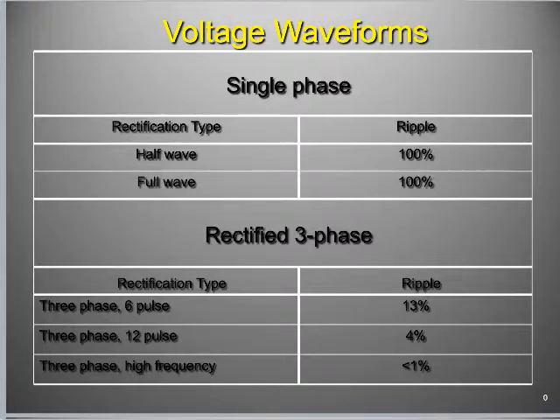But one of the significant things that's happening now, as I start to phase this out, you'll notice what happened with the ripple. It significantly decreased the ripple. Where did the ripple go? Well, you'll notice with this illustration here at the bottom of the page, when we started phasing it, no longer is it going all the way up and coming all the way down and all the way up and coming all the way down.